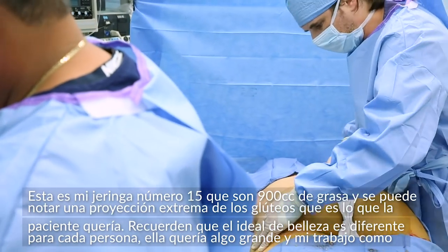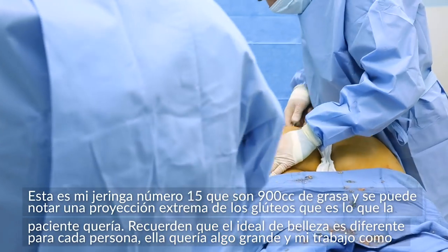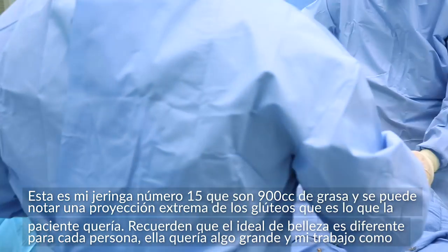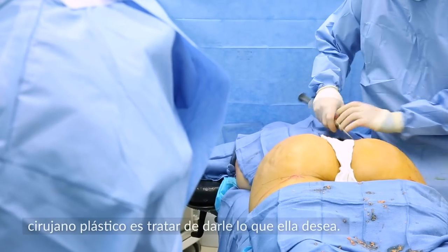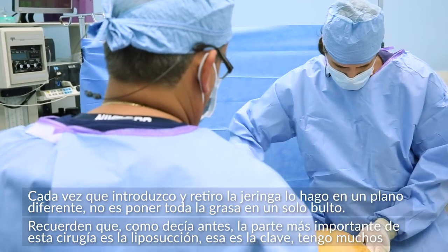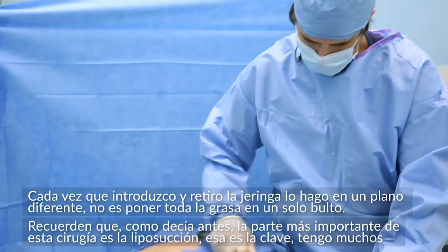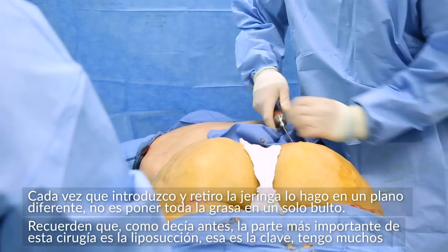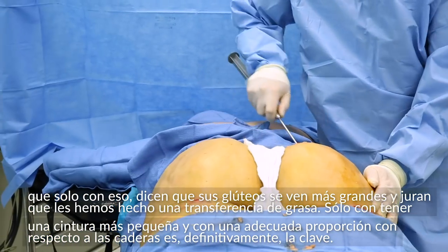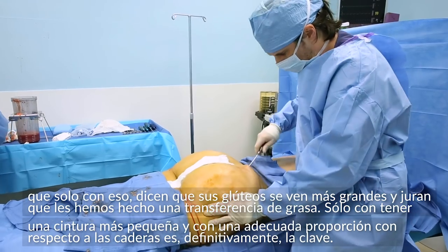This is my 15th syringe — we've got 900 cc's of fat inside. You can see she's getting some extreme amounts of projection, which is what she wanted. Everyone's ideals are different, and this patient wanted something on the larger side, so my job as a plastic surgeon is to try to get her that. Every time I come in and out, I'm going in a different plane — I'm trying to get all that fat throughout the entirety of the buttocks, not just lumped in one spot. Part of the important thing about this operation is really the liposuction. I have a lot of patients who just from the liposuction say their buttocks looks bigger, and people swear they had a fat transfer. Creating that tiny waist and getting the correct hip-to-waist ratio is definitely the key.